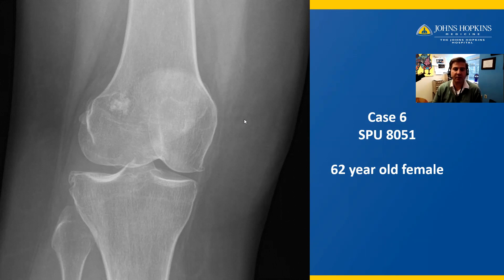Case number six is from a 62-year-old female. Here we have a plain film x-ray showing an abnormality in the distal femur metaphysis. This abnormality has a sclerotic border — you can draw a line all the way around the edges of this mass. The matrix is predominantly lytic, meaning dark, darker than the surrounding bone.